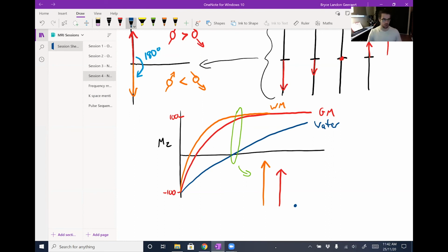And you can do this for other tissues as well. Some of you may have heard of black blood sequences. This is where the same concept applies, but you're considering specifically blood tissue instead of water, although they are fairly similar. Now when we're recording signal from our NMV, we are only really drawing signal from areas of human or body tissue rather than water and CSF and things like that. So you've removed an area of signal that you're not really interested in, and kept those areas dark, which can really help to improve contrast in your image.